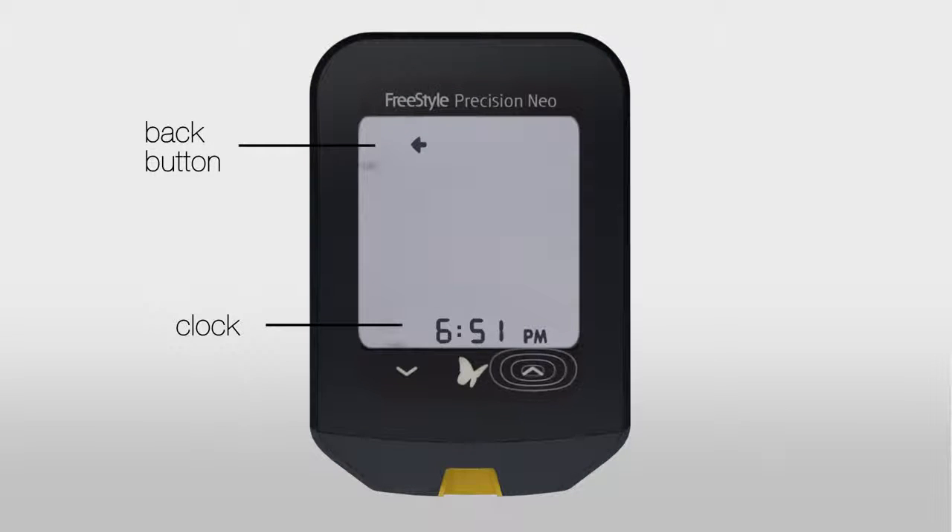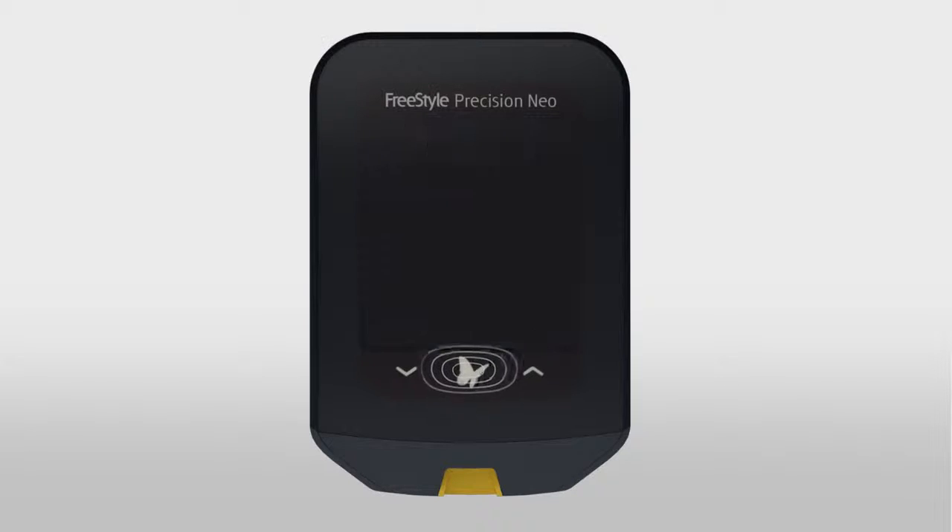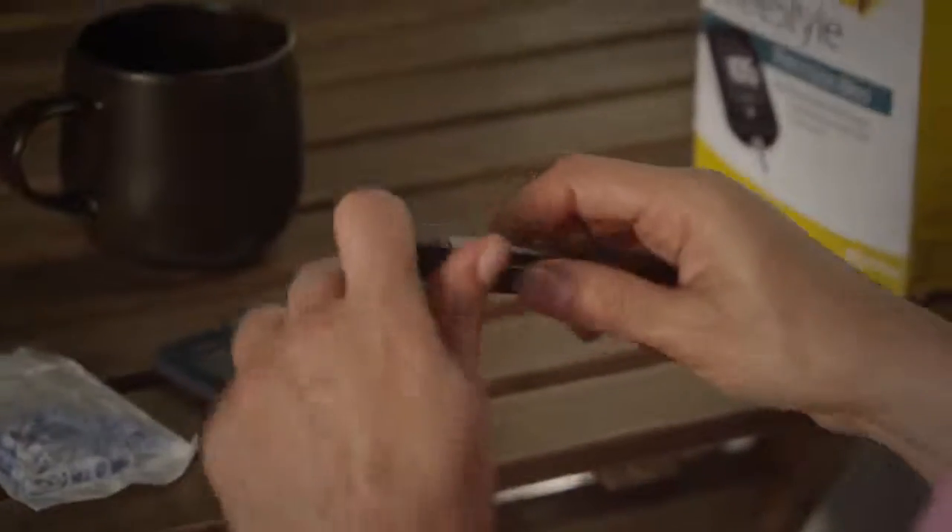Use the arrow buttons to select the correct hour, minute, and date. Change the year if necessary, then press the butterfly to save and continue. Congratulations! Your meter is now ready to use.